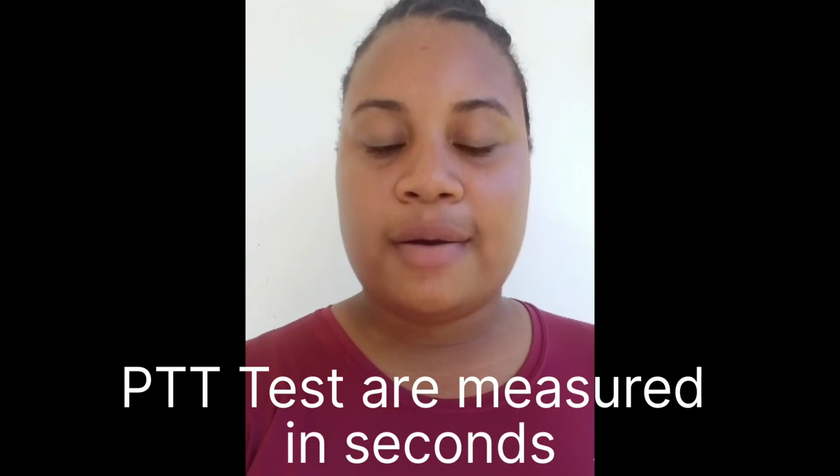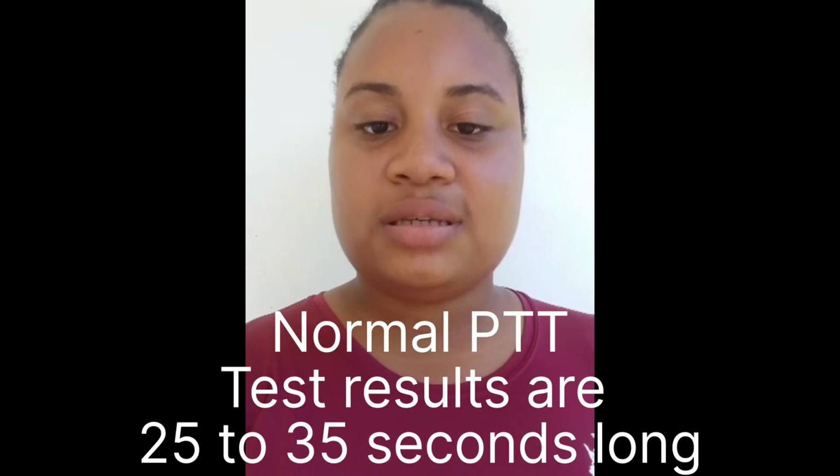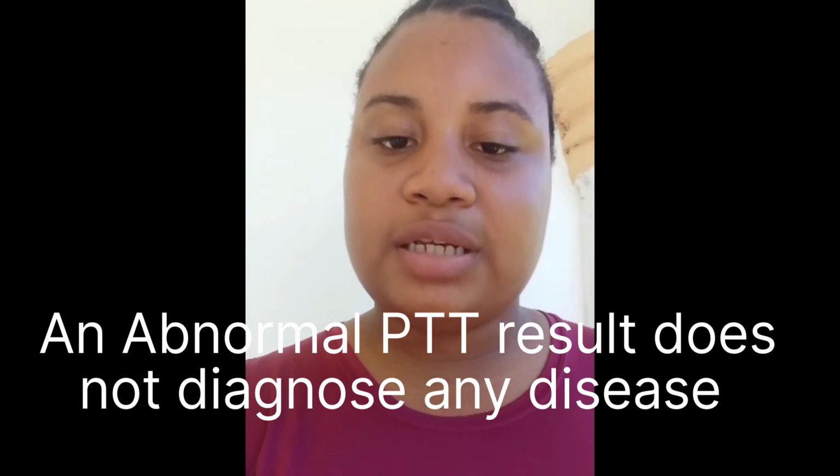Interpretation of the results. PTT tests are measured in seconds. Normal PTT test results are typically 25 to 35 seconds long. This means that it took the blood sample 25 to 35 seconds to clot. An abnormal PTT result does not diagnose any particular disease. It only gives insight on the time it takes the patient's blood to clot.